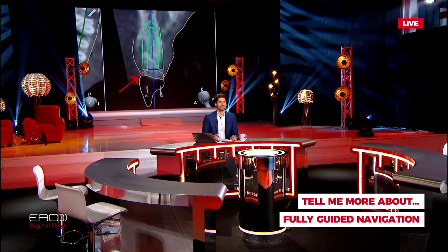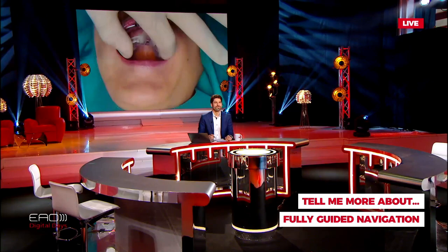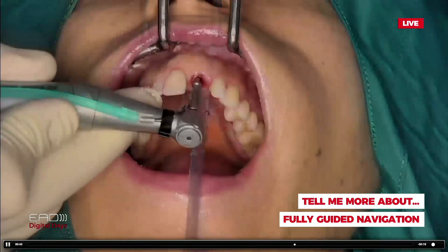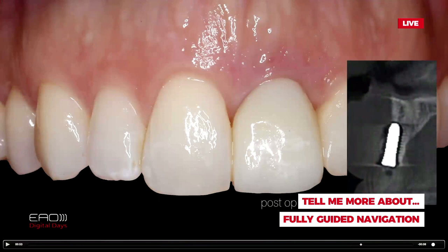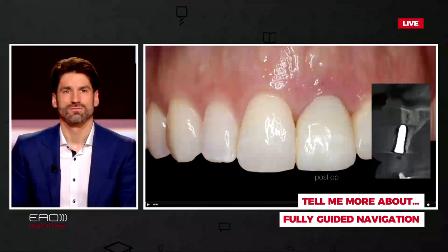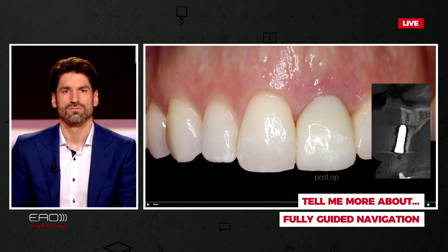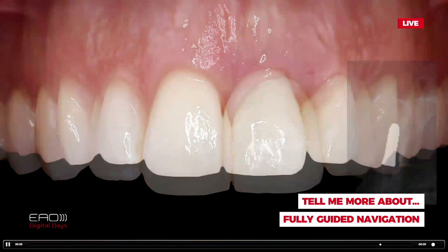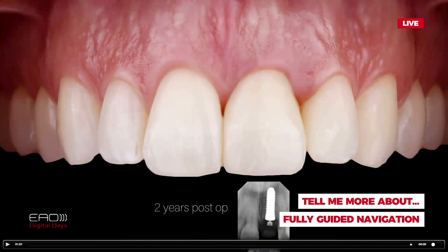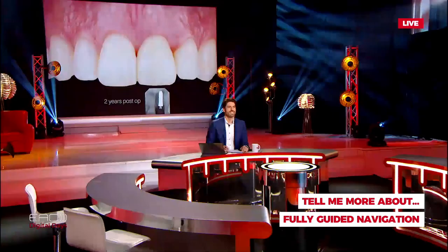In this case, the implantation was done partially guided, meaning we did only the two-millimeter drill and then went on without guidance anymore. If you carefully look, you see that the drilling shifted more and more to the buccal side. This was done with a ceramic implant, and if you look at the final picture, the x-ray shows that the ceramic implant has moved together with some parts of the hard tissue to the buccal side. Fortunately this was a ceramic implant — I strongly wonder if we had used a titanium implant whether the aesthetic result would have been the same, even after two years.